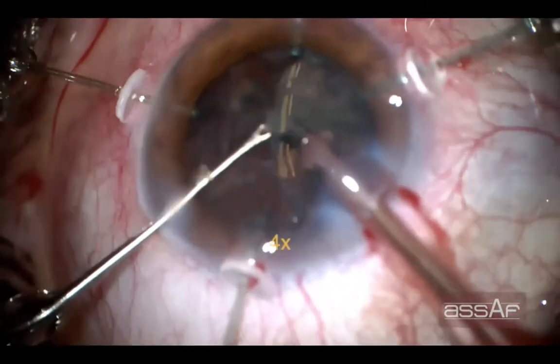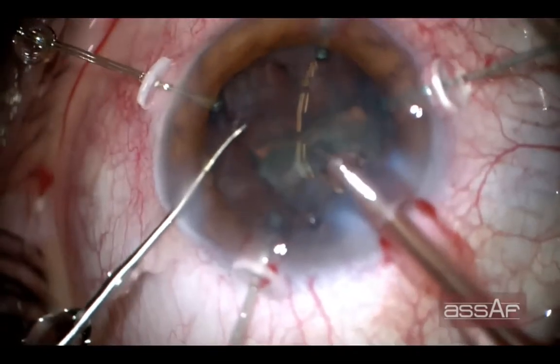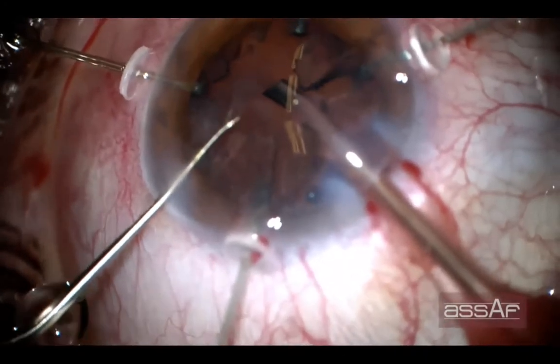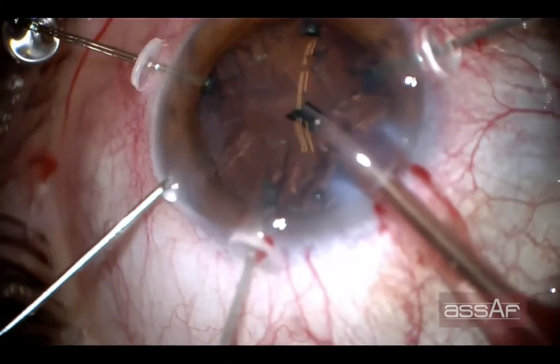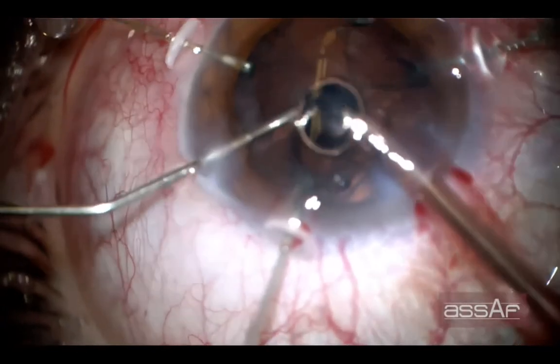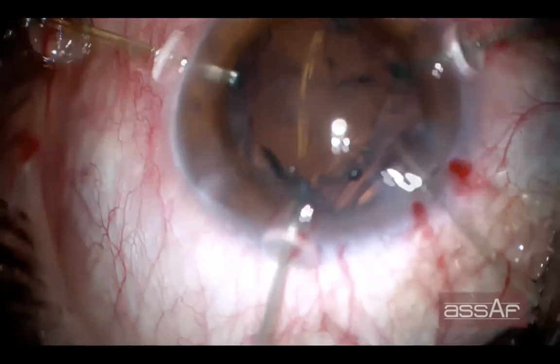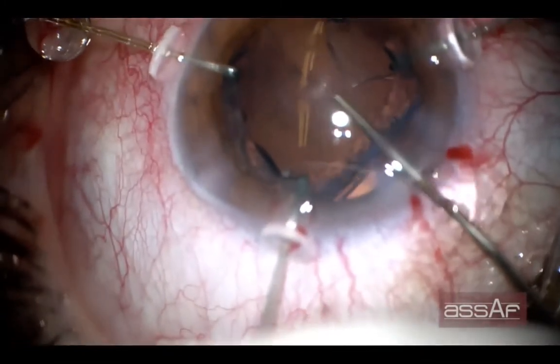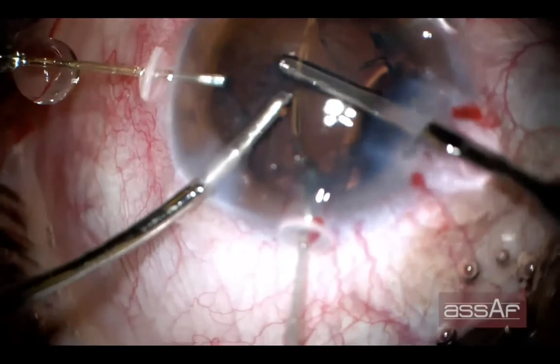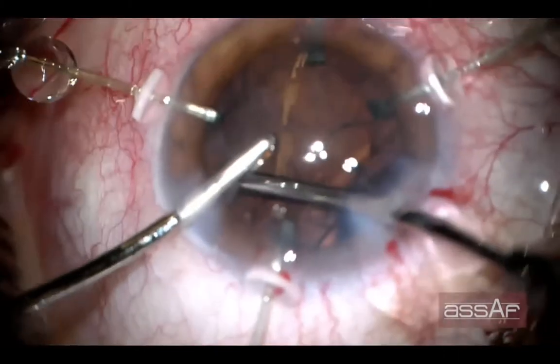And this is the last quadrant, so never allow the anterior chamber to collapse after emulsifying the last quadrant and pulling the phaco tip outside the anterior chamber. Before pulling the phaco tip outside the anterior chamber, it's advisable to inject OVDs inside the anterior chamber to reinflate the capsular bag and to minimize the possibility of vitreous prolapse into the anterior chamber. With injection of more OVDs trying to inflate the capsular bag, you can see that because of the redundancy of the lens capsule, the area of absent zonule is more appreciated now.